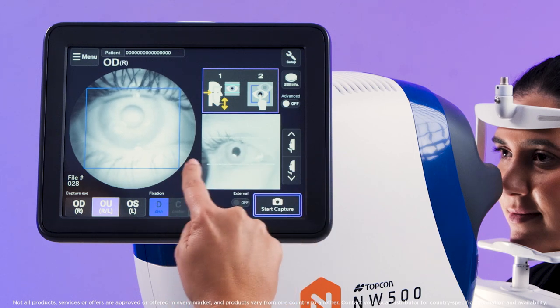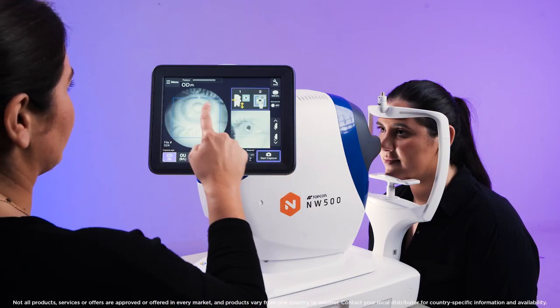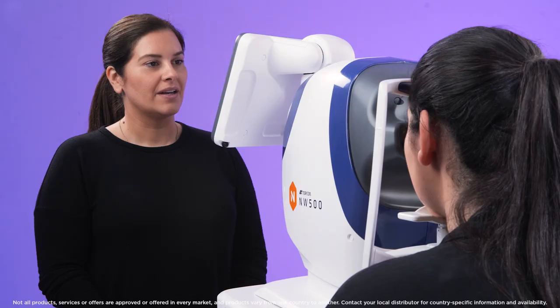The pupil should now be positioned within the two blue lines. Touch the centre of the pupil on the monitor to centre the camera.